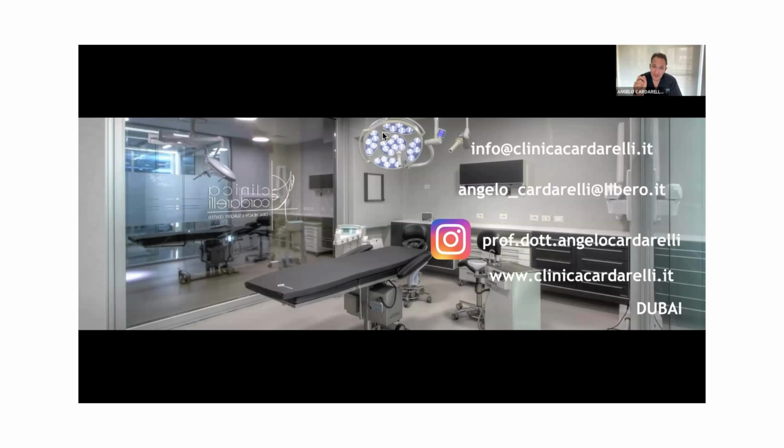I don't know if you have experience with cadaver dissection. The fat is between the periosteum and the tissue, exactly in the thickness of the cheek. In order to understand, the best way is to make some surgical incisions on a cadaver head, and then you can reach it more easily and find it during your surgery, but it is in the thickness of the cheek.